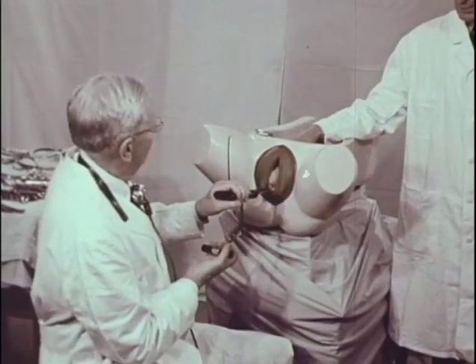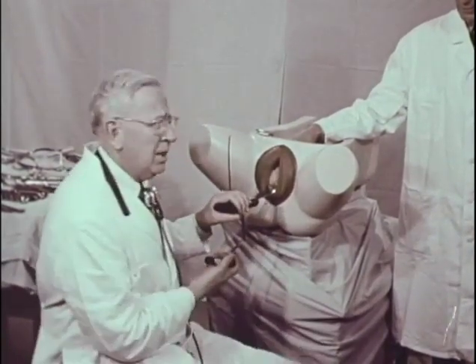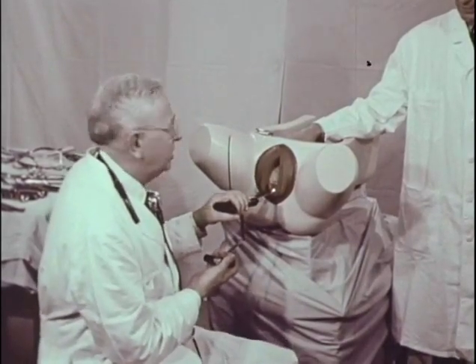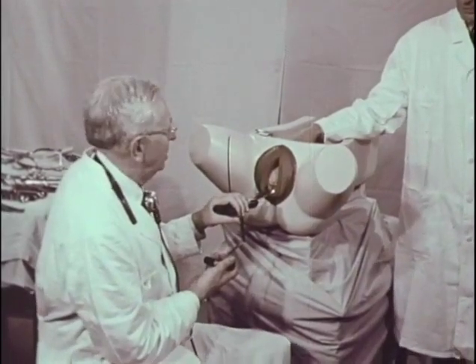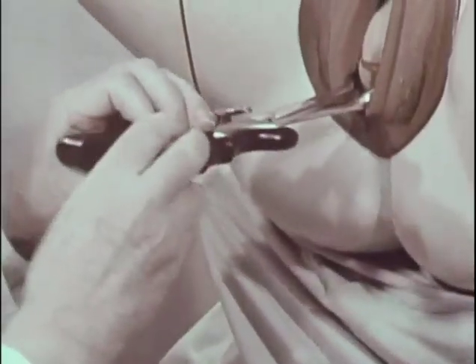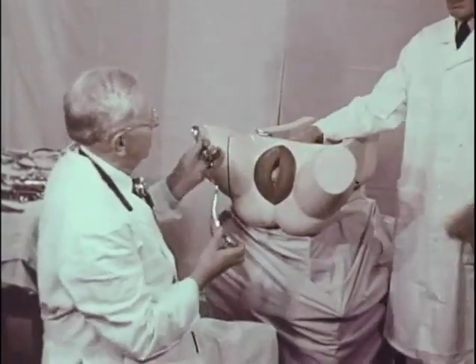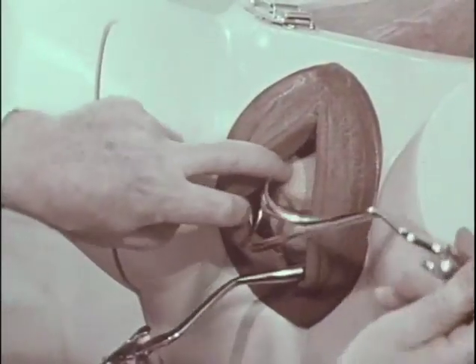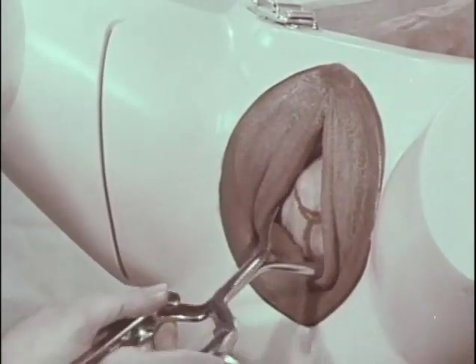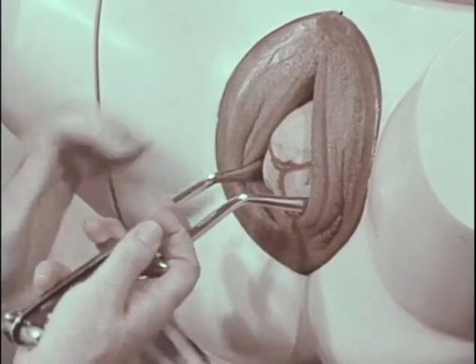One might ask, why use an Elliott type of forceps for traction on a molded head? And the answer is, if one anticipates slipping of the Elliott forceps on a long molded head with the forceps not well anchored below the malar eminence, he may remove the Elliott forceps and substitute a Simpson type for the traction, similar to the two forceps maneuver described by Sides. This gives the advantage of a long tapering cephalic curve of the Simpson forceps on a molded head.